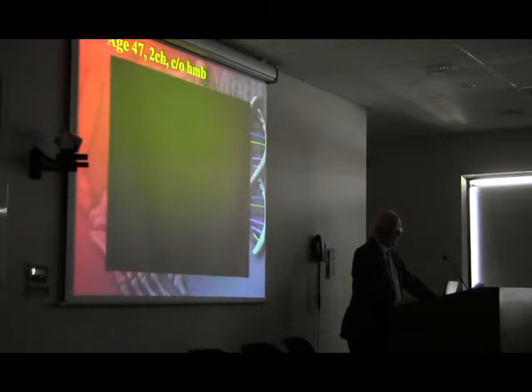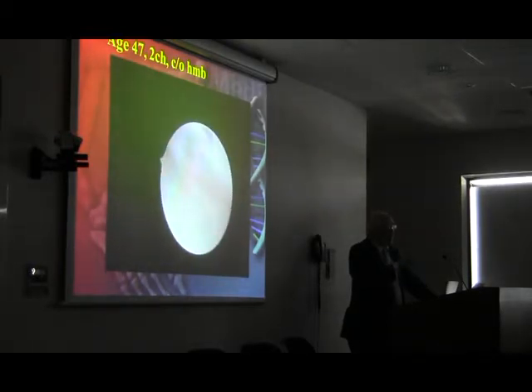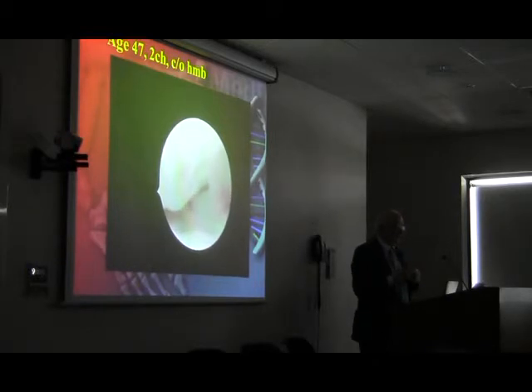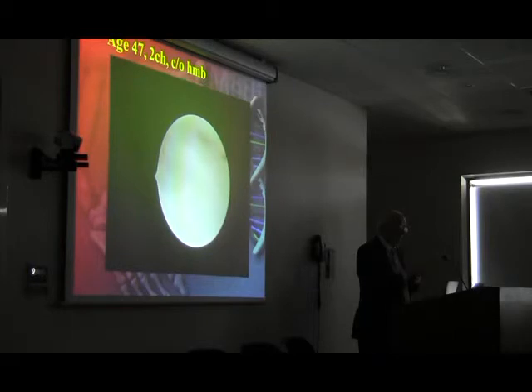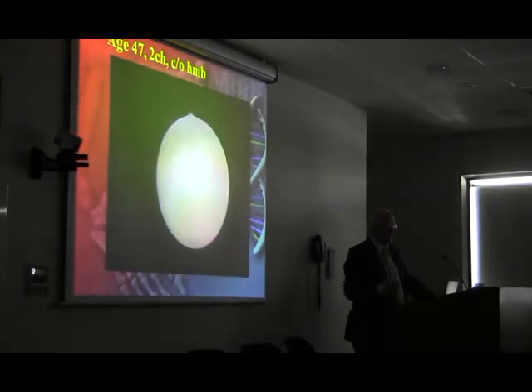Now, let's move on to another patient, a 47-year-old lady with heavy menstrual bleeding. So this now is the endocervix, and as we see, there's no pressure on the endocervix, and there's no bleeding or trauma with the scope. We'll bring the scope through here, and you can see from the flicker on the edge that it's looking sideways. There's a little bit of old blood there. You can see there are some adhesions just coming into the uterus, and this little bit is the part that the patient will feel, just that last little bit at the end of the cervix on the internal os.